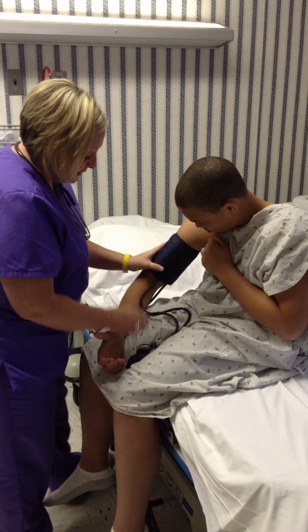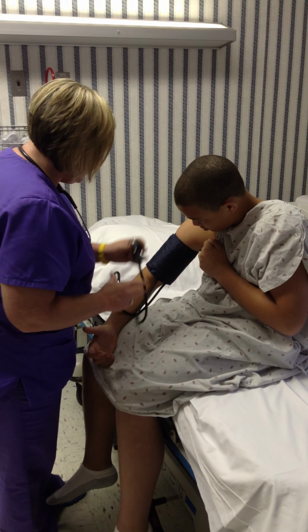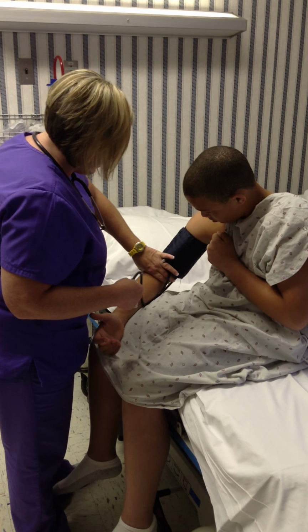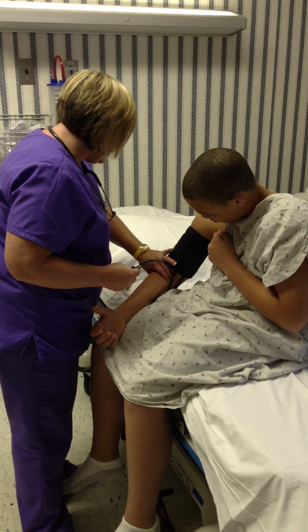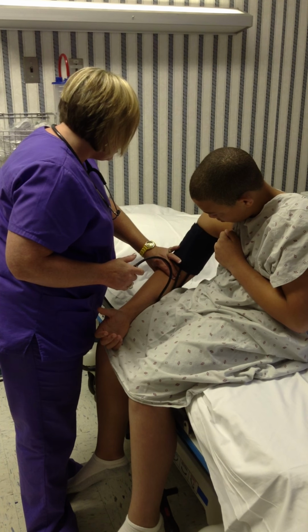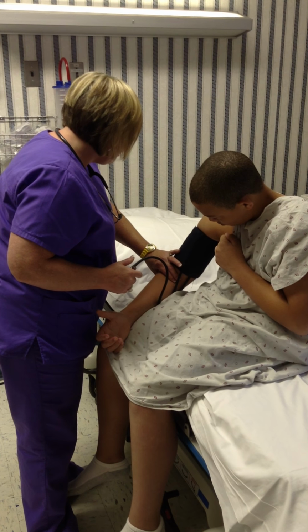Micah, I am just going to palpate. I'm going to pump the cuff up, and I'm going to place my hands on your brachial artery. Let me find it. I'm going to start pumping this up, and when I can't feel your brachial anymore, I'm going to go 20 over, okay?